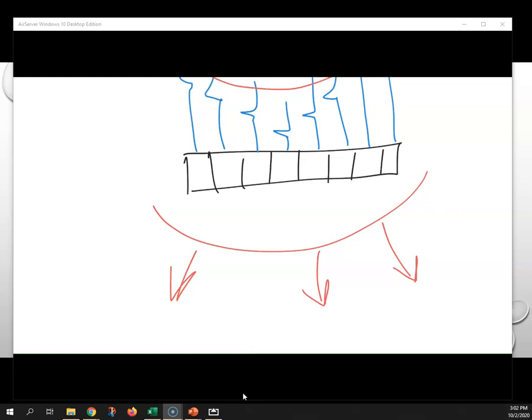Diverging as soon as it comes off of the beam. And this will not work. You can't get any kind of an image at all with this. So if you see this, this is not going to work. This is what they call a defocused timing pattern, and it does not work. It does not exist in the real world.